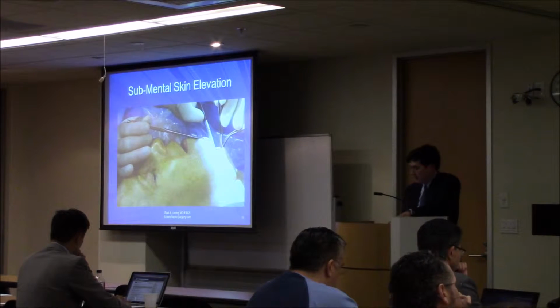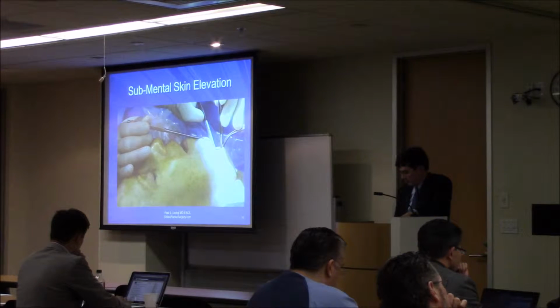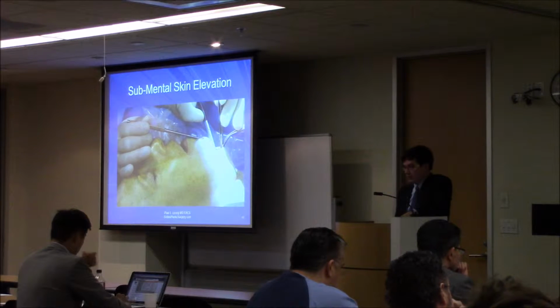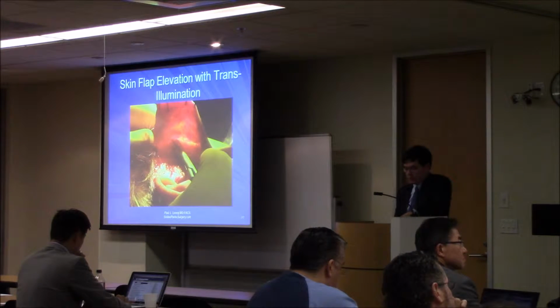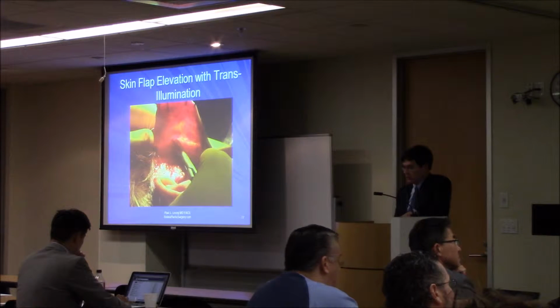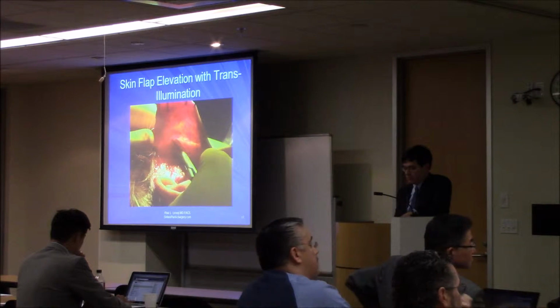Okay, as I think I answered a question earlier today, in about 2/3 of cases I will open the neck and do a corset platysmoplasty. I won't really show that video because it's not terribly interesting. As you saw in the previous presentation, I used this transillumination method with the skin flap.